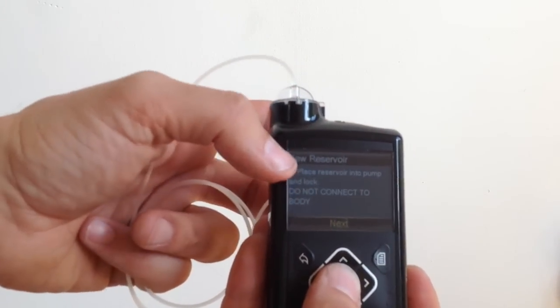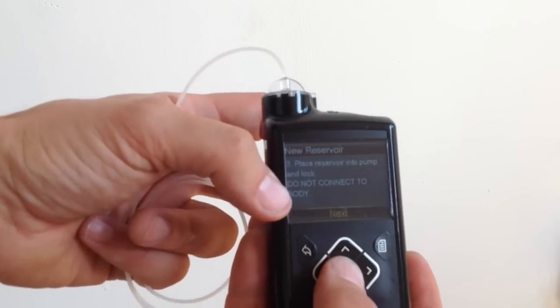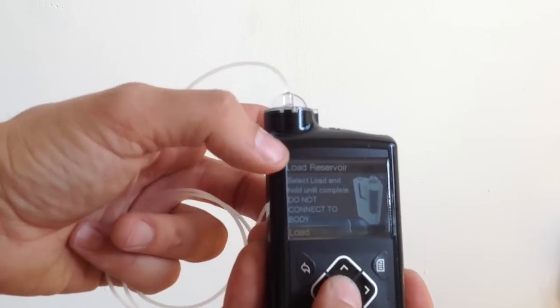And then click. And just round until it stops. So I've gone through this. I've placed the reservoir into the pump and locked it. And then next. And the centre button. And now we're doing the load.